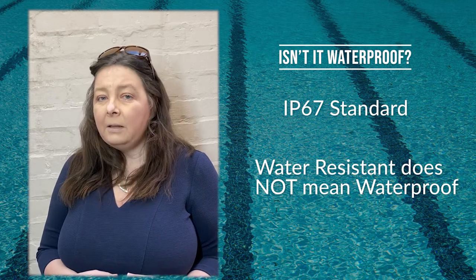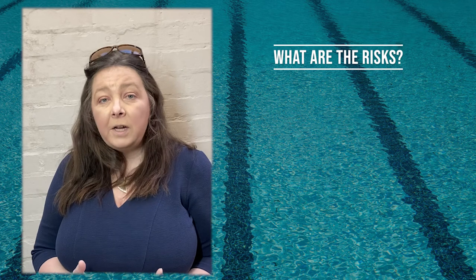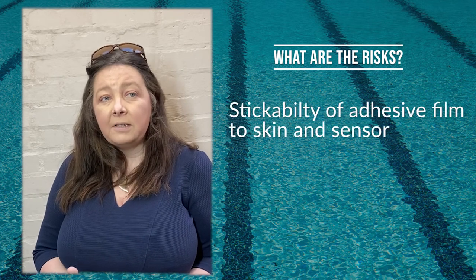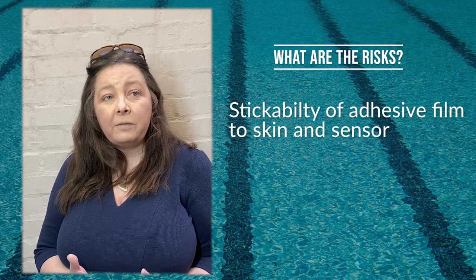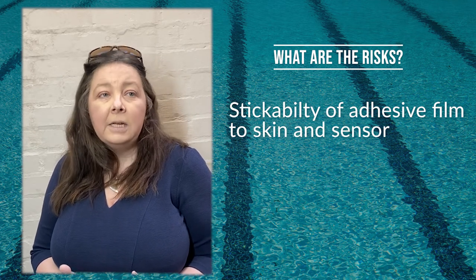So does that mean that if I stay in for too long the sensor is likely to come off? There are two risks here. Firstly, there's the stickability of the sensor to the skin or whether the sensor is attached with the sticky film itself. These types of issues are more likely.